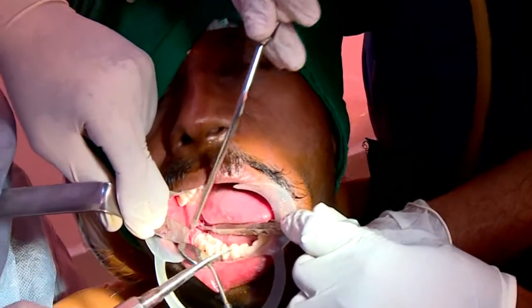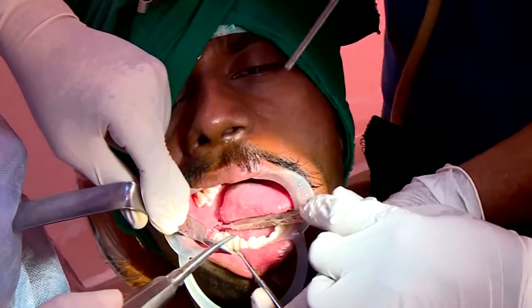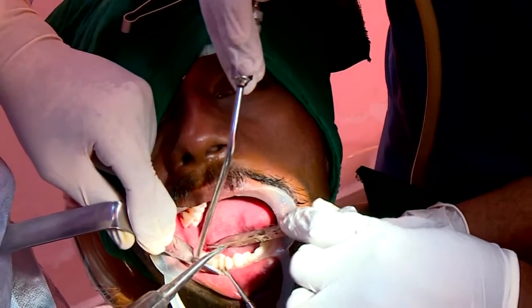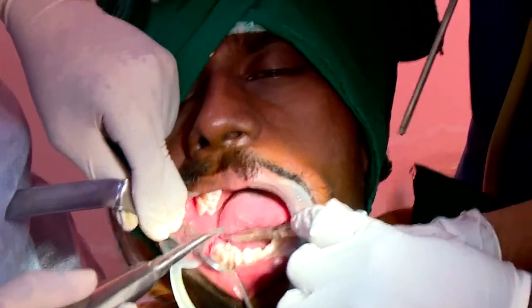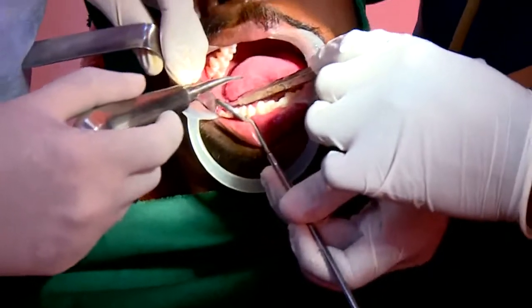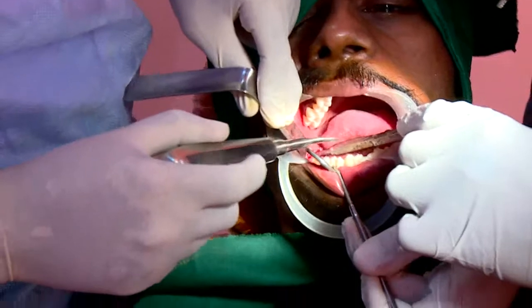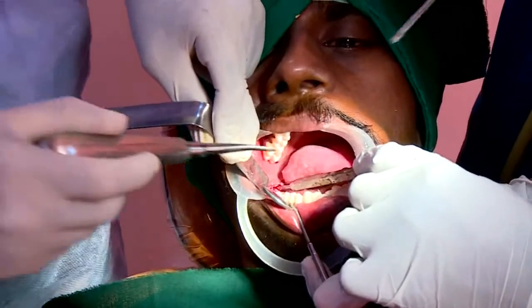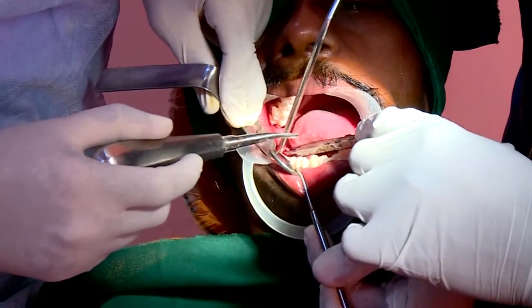Yeah, it is more like an oblique split, okay? The angulation is very important. My preference is to give a broader cut on the upper side and a narrower cut on the lower border, okay? So that's very important. Once the adequate split is made, I'm going to just down fracture it. I'm going to split the crown alone.